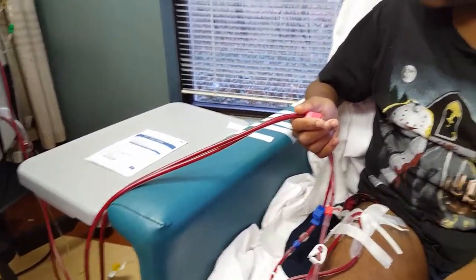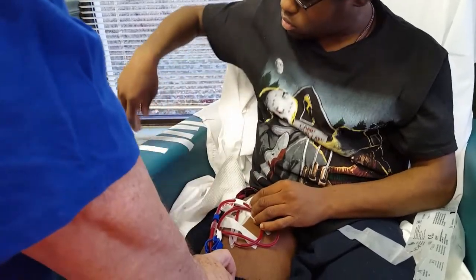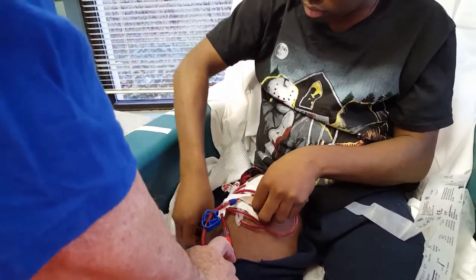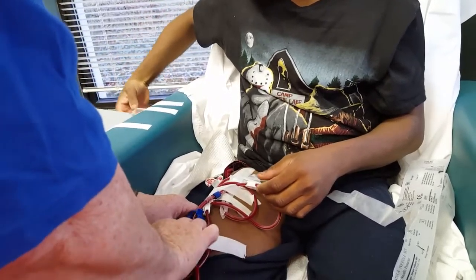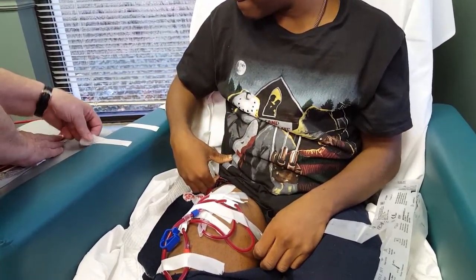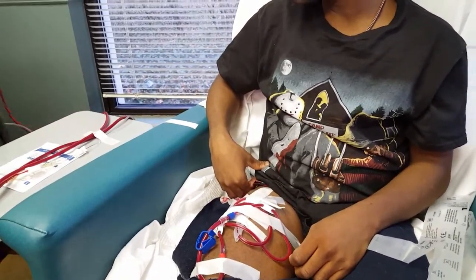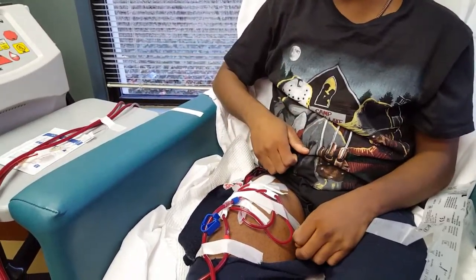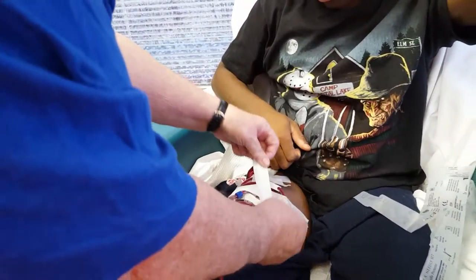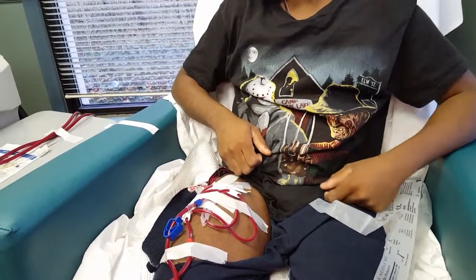Okay. And then I just do this around, like in a circle. Take a long piece of tape. That's not long enough. I'll put more on. Well, I cut it kind of torn, kind of short. Usually I tear them longer. Everything's going fine. What do you do with that last piece of tape? Oh, nothing. It'll be there for when we come off. There you go. We'll just leave it there. All right, there you go, son. All right, stop the video.